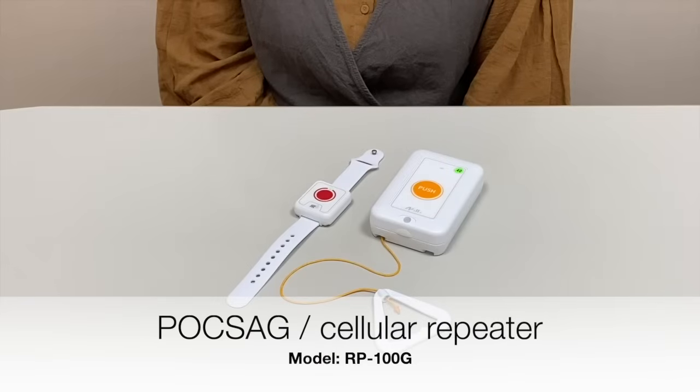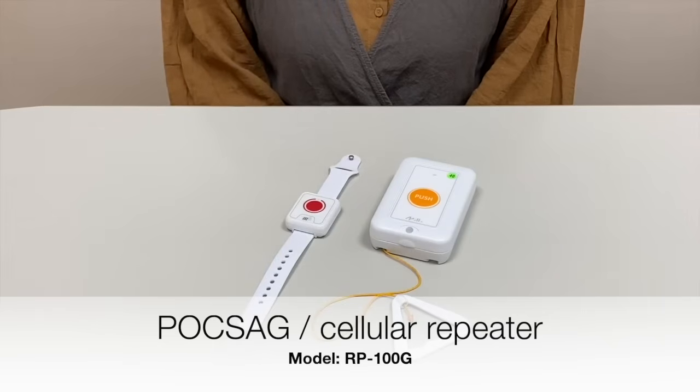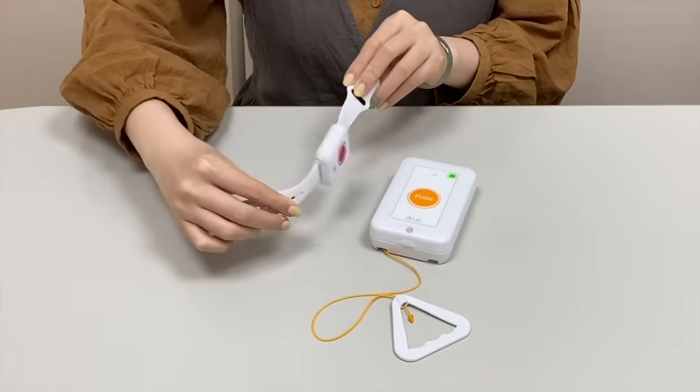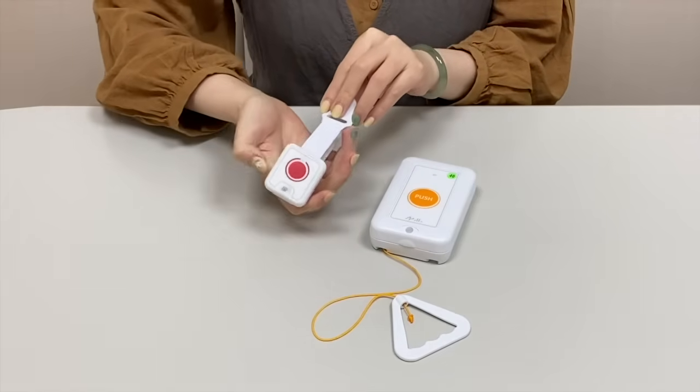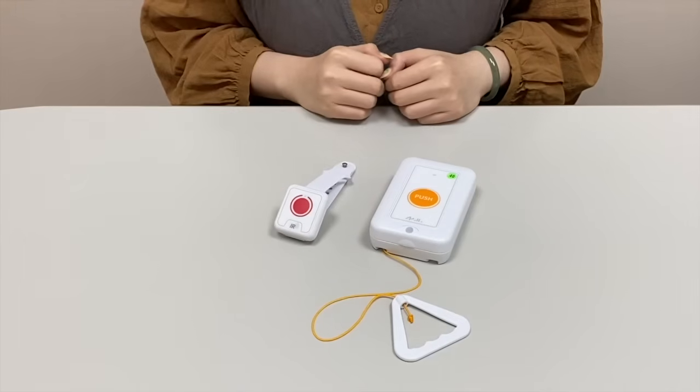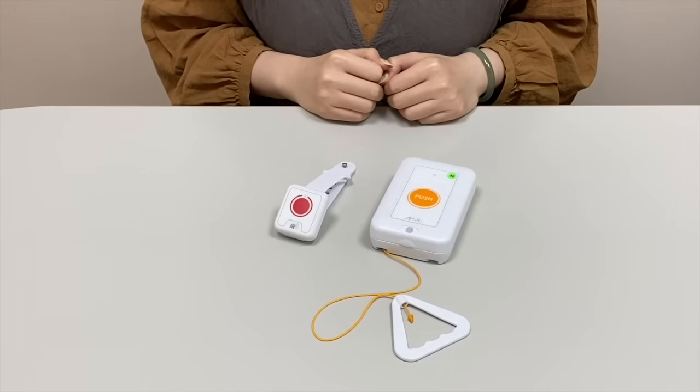In order to do a demonstration video clip on RP100G, we have picked JD170 transmitters. JD170 transmitters are ideally for users to wear over their wrist. Whenever they require assistance from the caretaker, they can actually call for it.